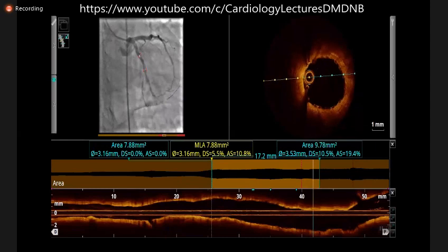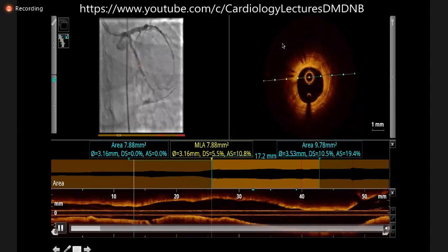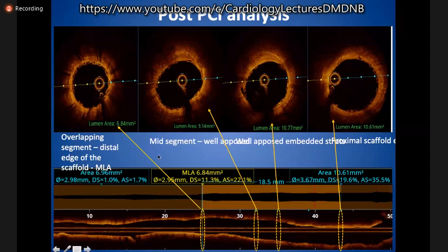So it's a recently done case, and the patient is doing reasonably well with the clinical follow-up. And we'll just do maybe a second angiogram in 6 months time. These are the pictures we have taken. Like in the end, the scaffold is all along very, very smoothly deployed, and I can't see much of the under expansion. And if you see, the MLA is 6.84, 6.96, and about say 10.61 at the proximal edge, just looking wonderfully well.